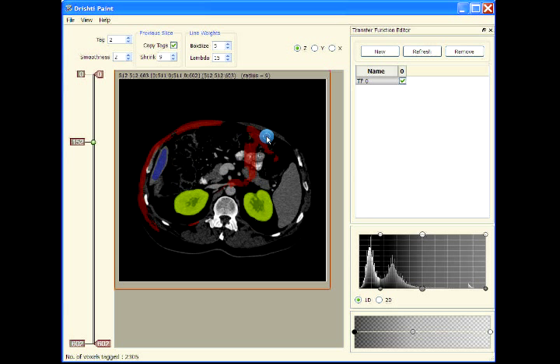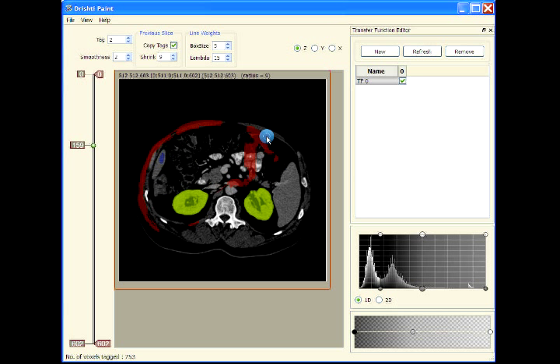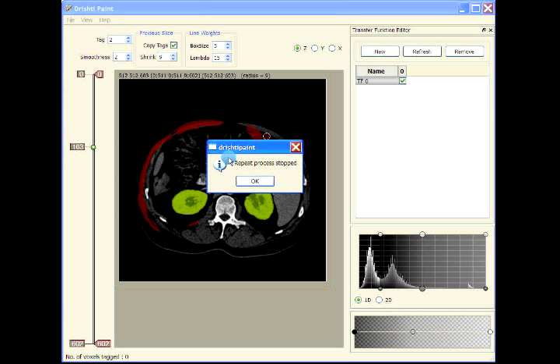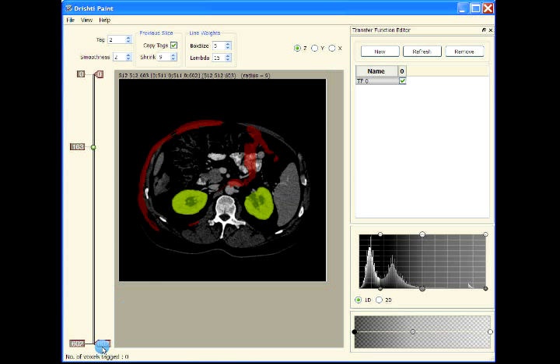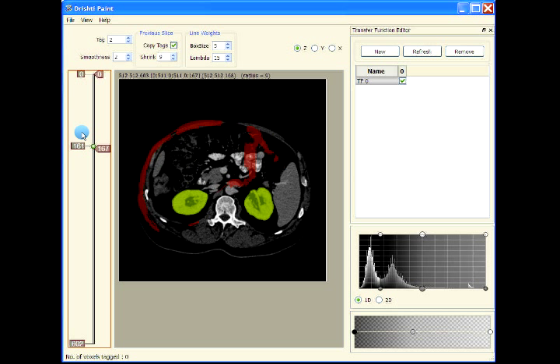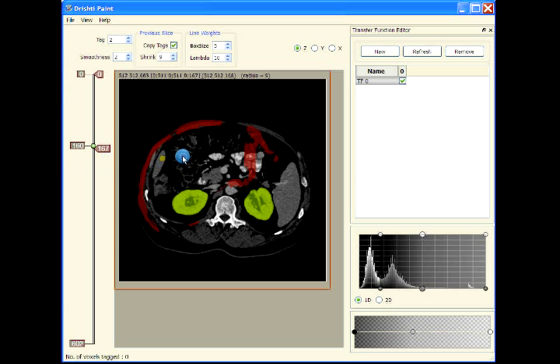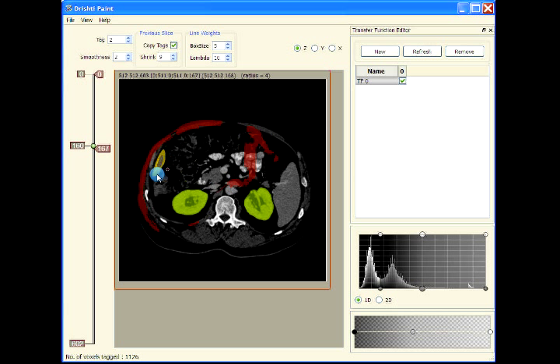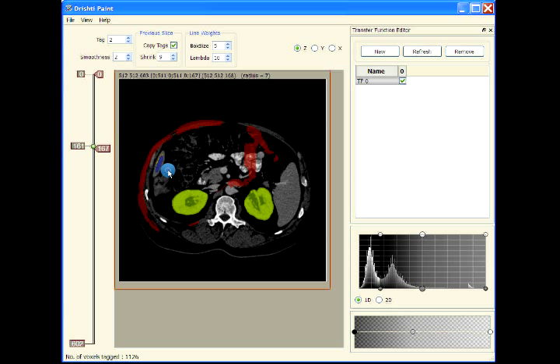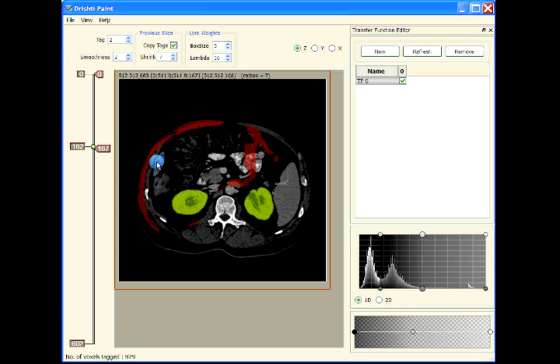We might have to go back and refine our segmentation, which we will do now. We'll change the box size and lambda, then apply. We can also apply it here. Tag, tag, tag, and then just erase that by the tag. We might reduce the shrinking as well.